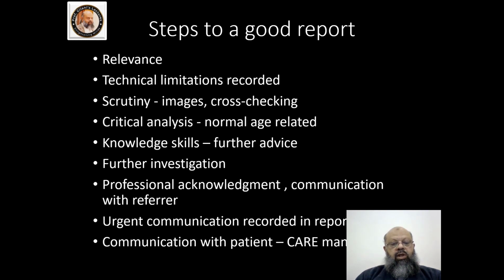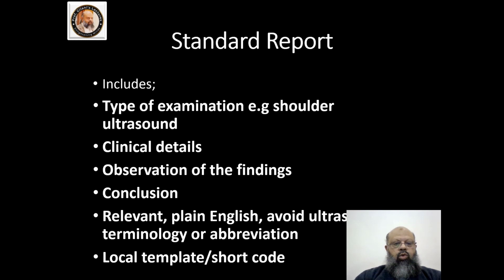Any urgent communication is recorded and reported, and communication with the patient is important, and care is very important before we start and after we perform the examination. We have to take care of the patient and the comfort of the patient. A standard report includes the type of examination, for example shoulder ultrasound, the clinical details, observation of the findings, then the conclusion. Use relevant sentences in simple plain English, avoiding ultrasonographic terminologies or abbreviations so that the patient can even understand the report. Use a local template and short code.